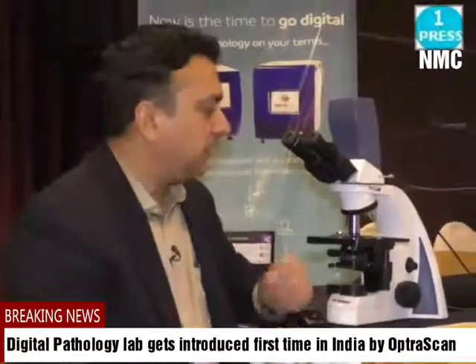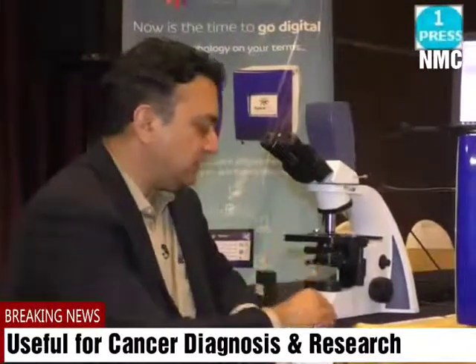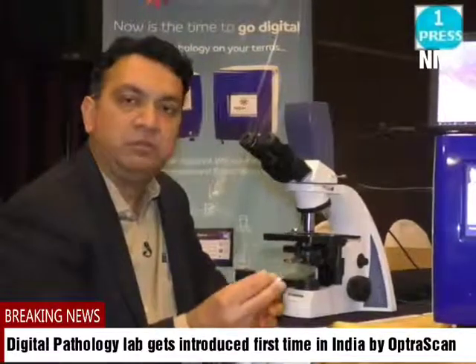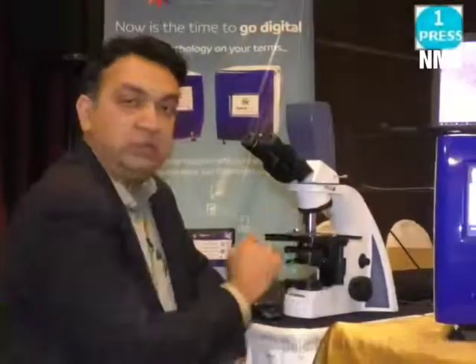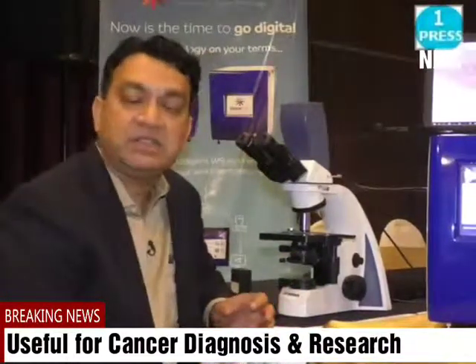So what we have done is that you have seen this kind of microscope, and this microscope is an optical system that has been there in the market for hundreds of years. If you go to any lab, you see this kind of system. The benefit of this system is that pathologists are used to looking into it, at glass slides, and these glass slides have cancer tissues. So if a patient comes with cancer symptoms, such slides are made and kept under this microscope. Pathologists will look through this microscope and write on paper the diagnosis of the cancer that they see on this slide.